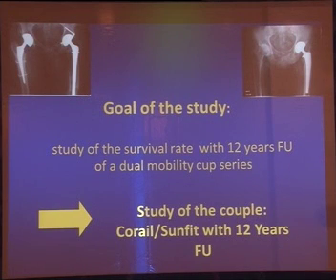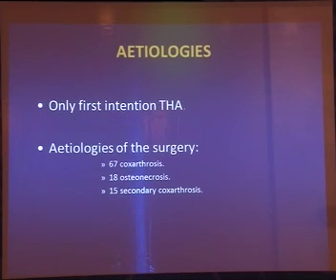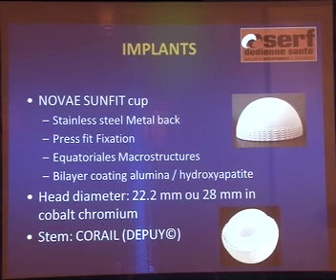The goal of our study was to analyze the results of a series of 100 primary total hip arthroplasties combining a SynFit dual mobility cup and a Corail femoral stem. We conducted a retrospective, monocenter, continuous and homogeneous series. There were 38 females and 62 males. Two patients were lost to follow-up and 15 patients died with their prosthesis in place, and the death was not implant-related. We included only primary surgery and the most prevalent etiology was osteoarthritis of the hip.